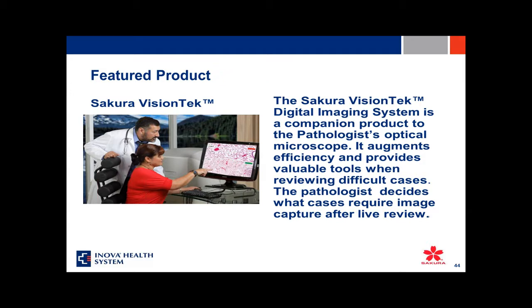So washout period is actually defined as the time gap between the pathologist reads the manual read versus your digital read. I think it's a very important step in your validation procedure because the pathologist is actually the gold standard, and he is the one who is evaluating your digital readout and how close it is in comparison with your manual glass slide. So the pathologist reads the glass slides, and it is highly possible that pathologists do remember what they see on the glass when they see the digital slide.